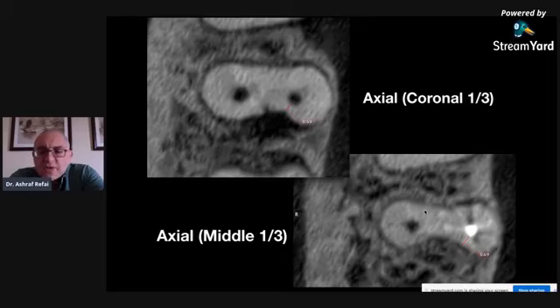So there was quite a high risk of me perforating, because the minimum enlargement that I may do when I'm trying to retrieve an instrument is about 1 to 1.2 millimeters. So there's a very high potential risk for a perforation, and I explained to my patient that that may happen.